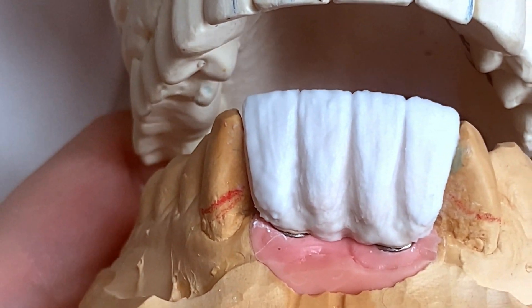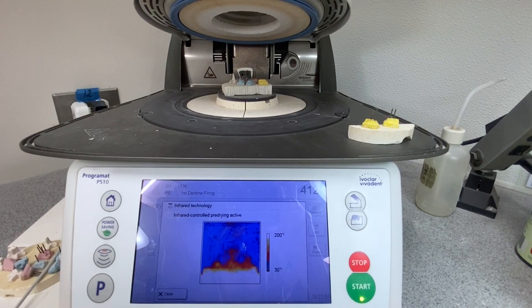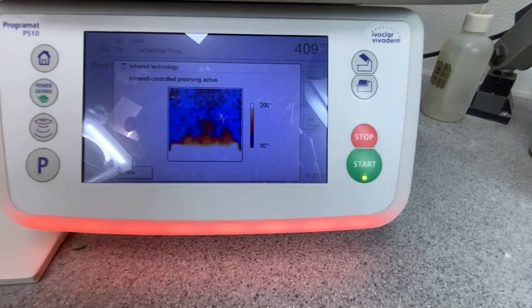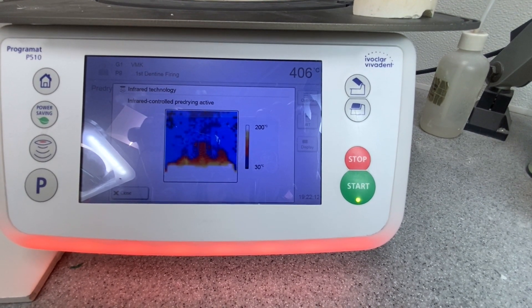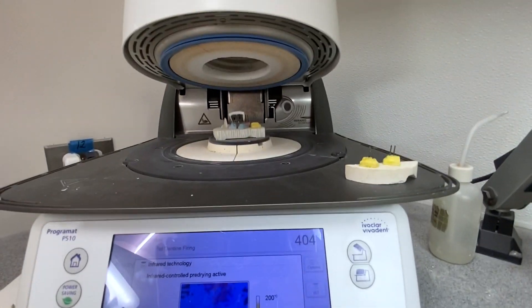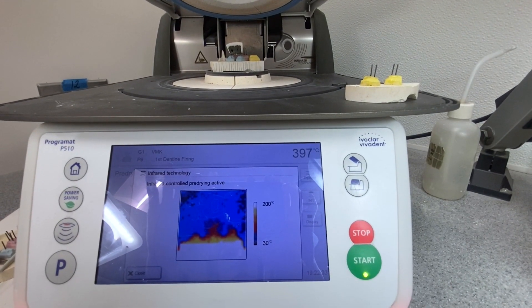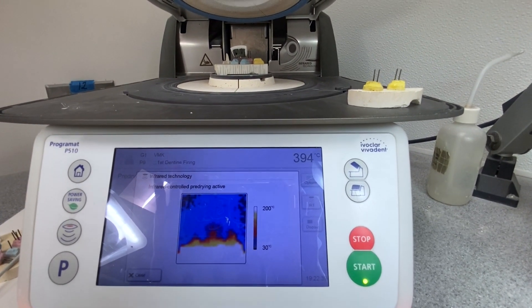I'm going to put it to bake and I'll see you after bake. The bridge is in the oven. The cycle I used is called IRT - infrared drying cycle - and I usually use it for my glaze program, but this time I decided to use it for this. Hopefully it's going to make it better. We'll see what comes out.